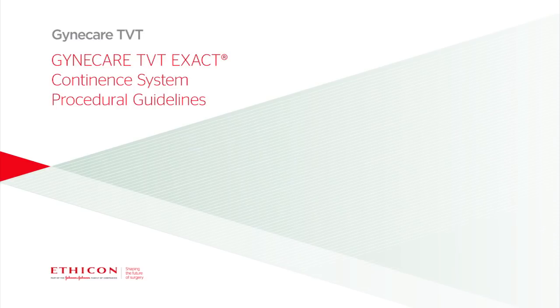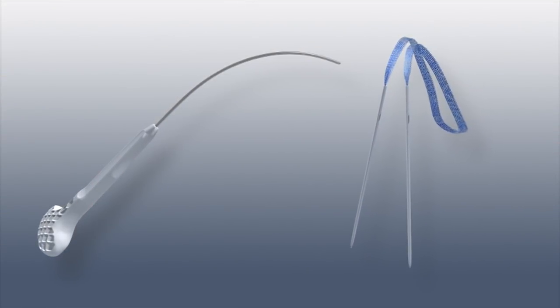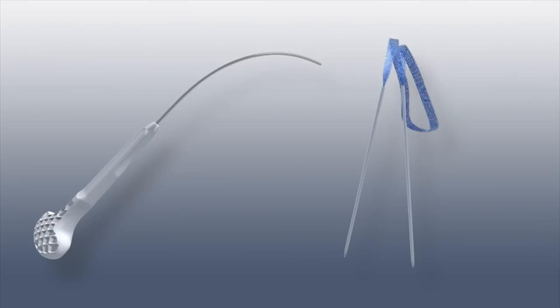This is an abridged version of the Gynecare TVT Exact surgical procedure. Please refer to the IFU and surgical technique for complete instructions.